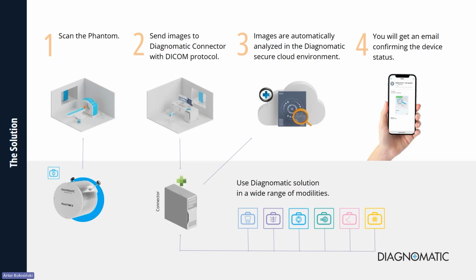So it saves us another time and automatizes the whole process. We don't have to physically log into the computer, just make the acquisition, put the DICOM node in this program, the IP address of the machine, set the port, and everything is button up. Once we make the acquisition, it goes directly to the cloud to be automatically analyzed, and we receive the report in a few minutes.